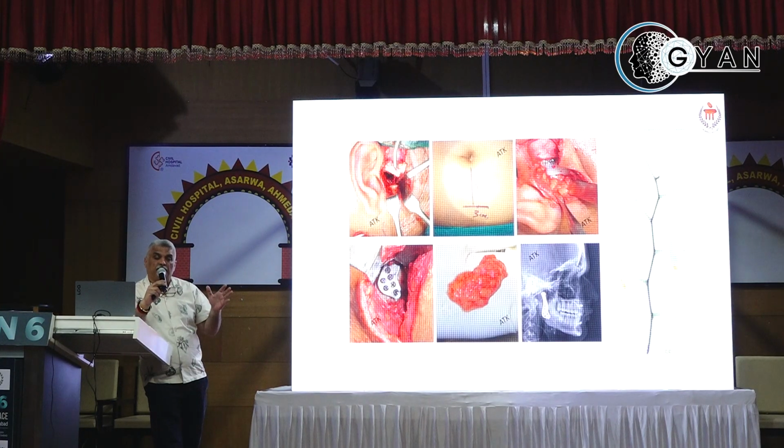So what do you do? Once you've done your TJR, all you have to do is irrigate that area with a 2 ml or 3 ml syringe of saline and prevent that saline from falling out of that cavity. If the cavity where you've done the TJR holds 3 ml of liquid, it's 3 ml of fat that is to be placed at the neck or the stem of the joint. Is that clear? That's how you determine how much fat you need to put in.